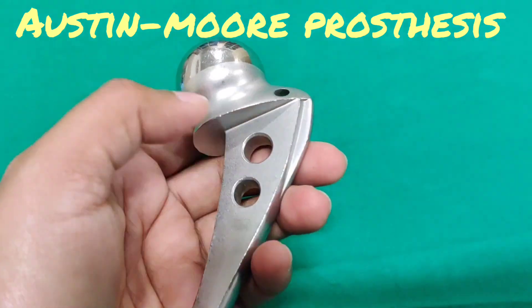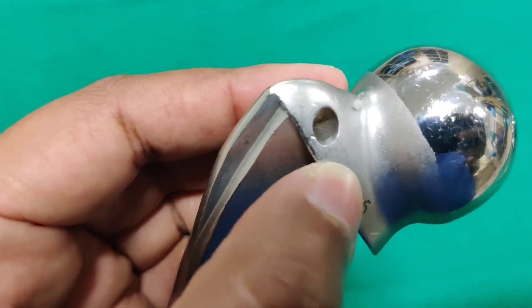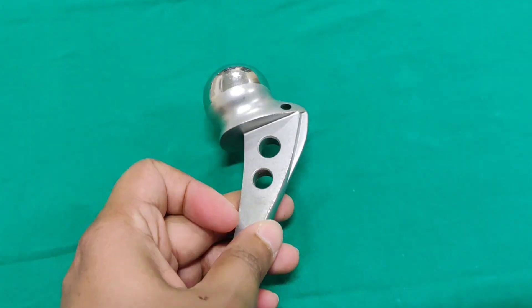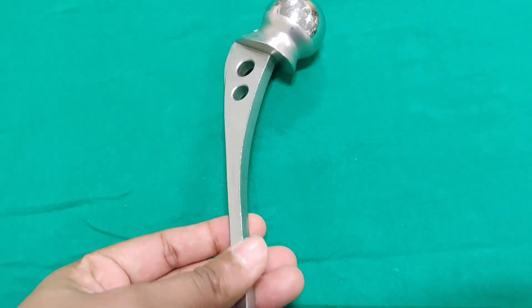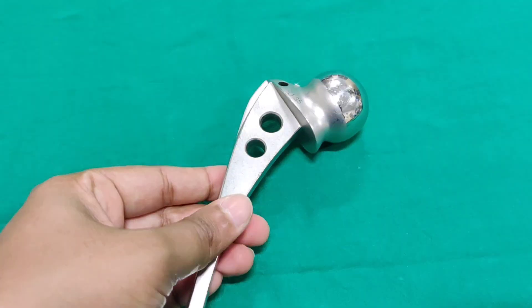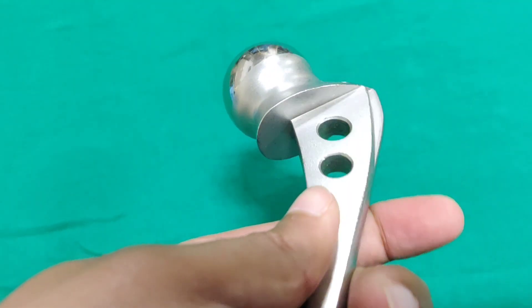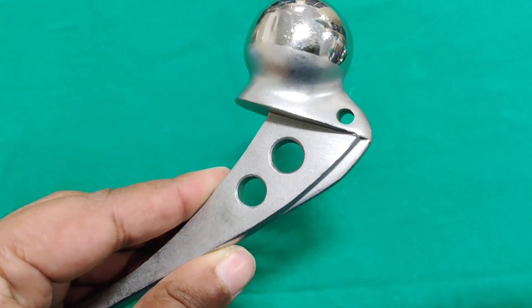Next is the Austin Moore prosthesis. It has a head, neck, collar, stem, and a shoulder. There is a hole present in the collar region — this hole is for maintenance of anteversion and also for removal of the prosthesis. There are also two holes in the stem which help for bone ingrowth, stabilize the implant, and make it lighter compared to the Thomson prosthesis.